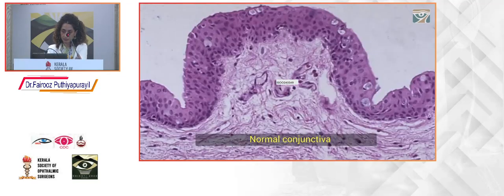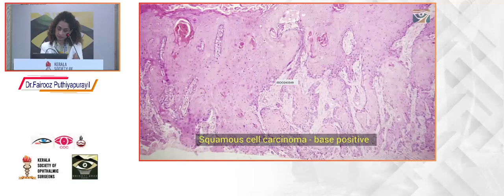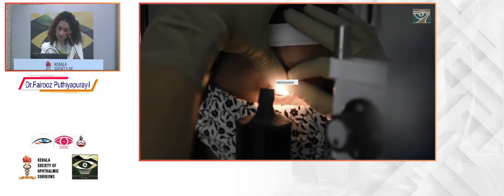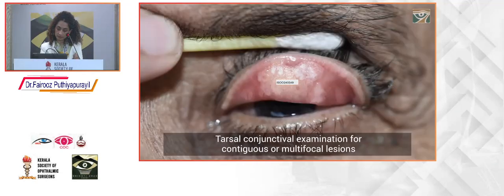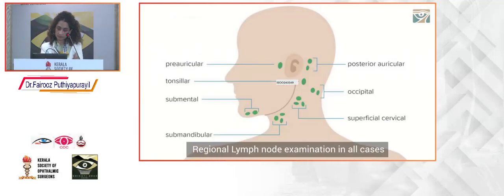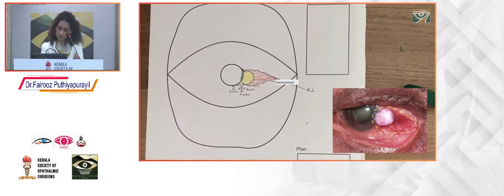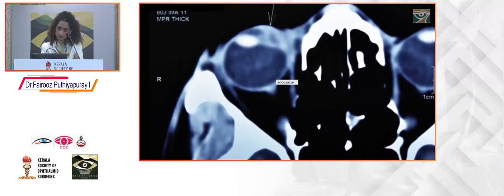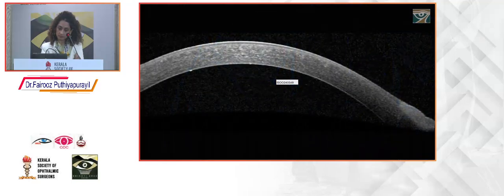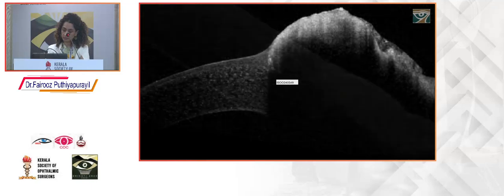Histopathology helps in the definitive diagnosis. Clinically, it is difficult to distinguish the spectrum of histopathological subtypes. Meticulous clinical examination and protocol-based management play the key role in appropriate management. Every case should be thoroughly, clinically documented to assist in the management. Although OSSN is a clinical diagnosis, imaging with anterior segment optical coherence tomography and ultrasound biomicroscopy provides valuable information in assisting in the management.